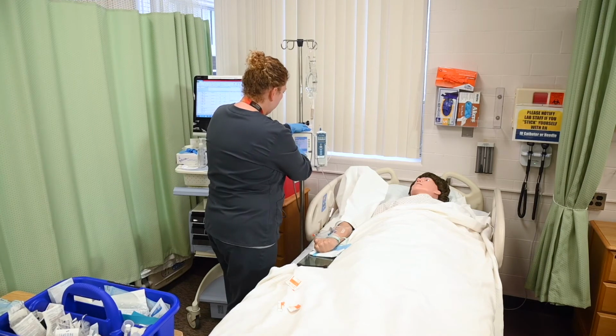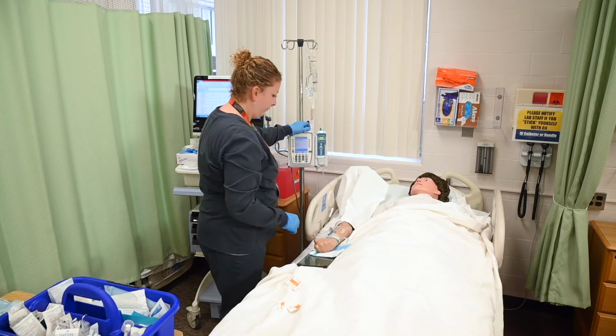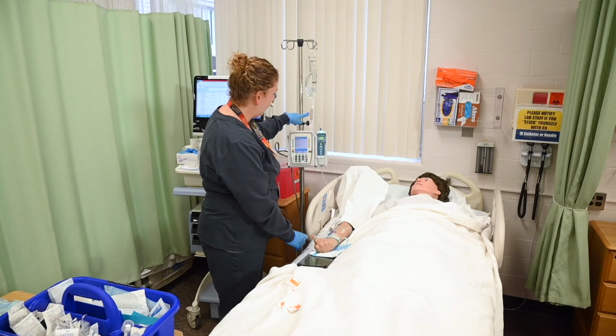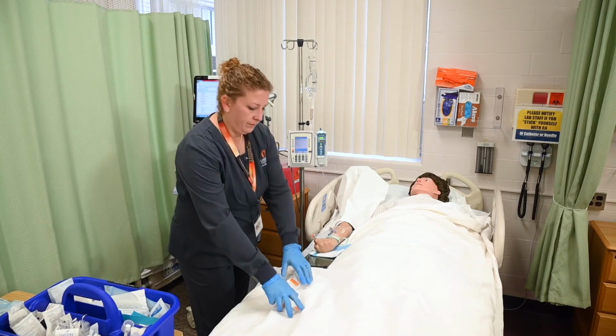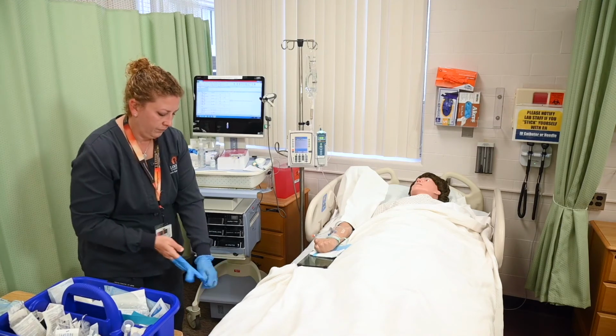Point nine normal saline, rate is 100, volume to be infused. There's about 500 left in the bag. Checking the line to make sure the clamps are open and the green light is on, watching the drip chamber to make sure the IV fluid is infusing. Dispose of used supplies in appropriate containers. Remove gloves, perform hand hygiene, and apply clean gloves.